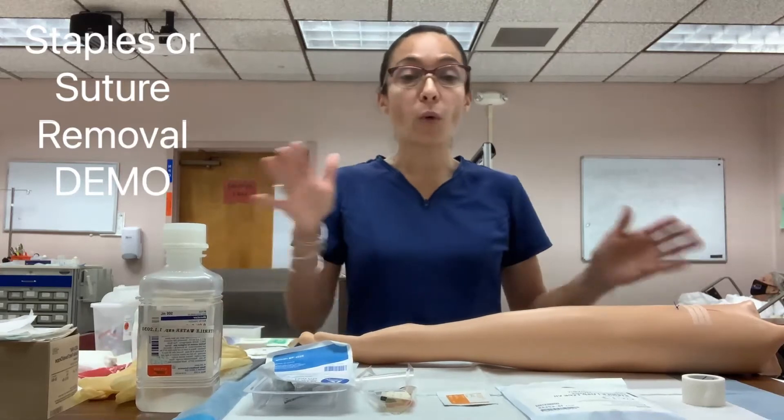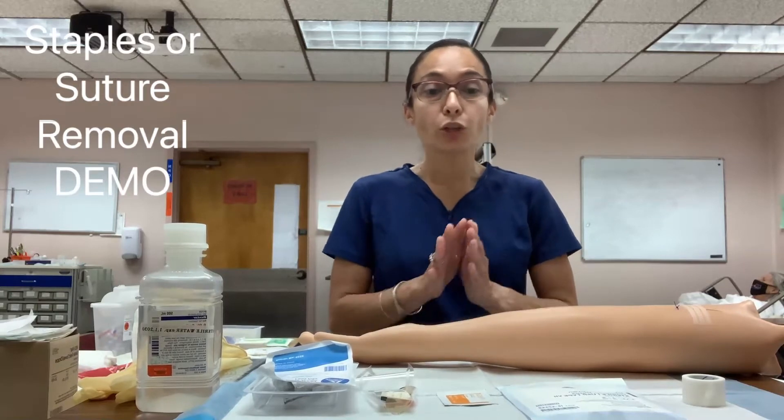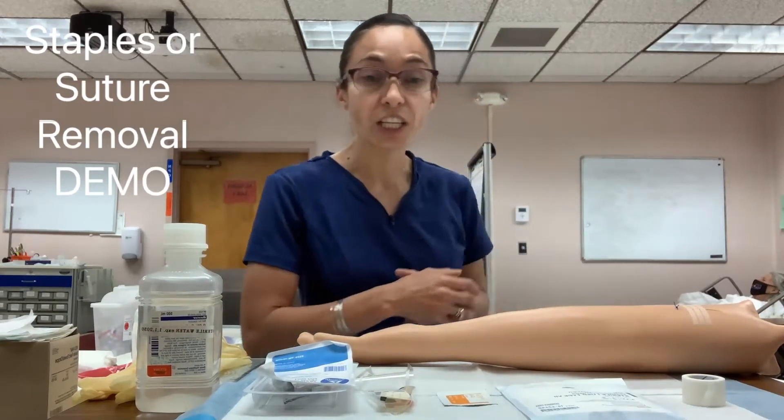When you get an order for staple or suture removal, you first need to confirm that the order is correct, then go talk to your patient, identify them, and explain the procedure. One very important thing is to assess the pain level — if your patient has pain, they might need to be medicated prior to the procedure. If you give medication, wait, follow up with the pain level, and then proceed with the skill.